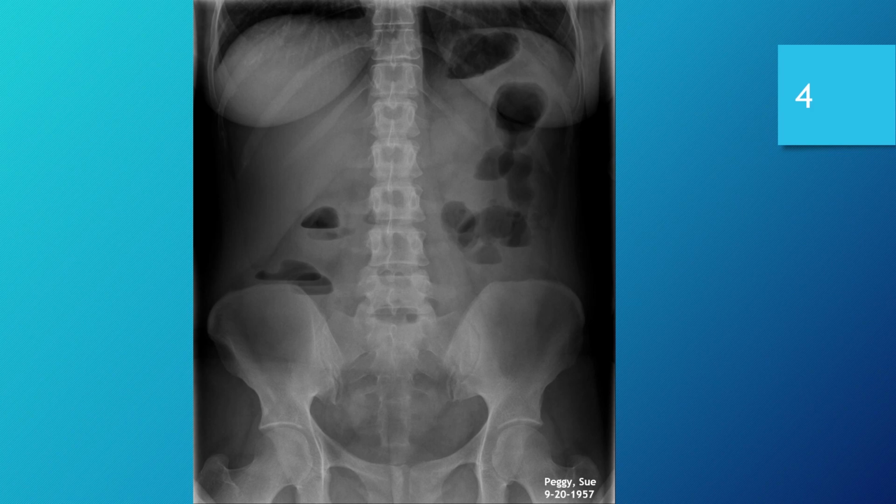All right, everybody. Well, here we are. We have another abdomen image to do some analysis on. So let's just jump right in and get started. So in this image, we have moved to an upright abdomen.